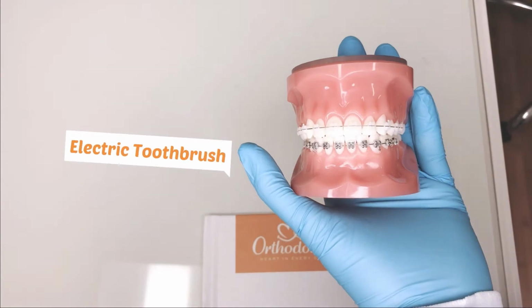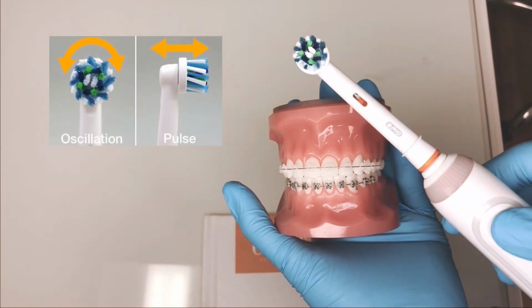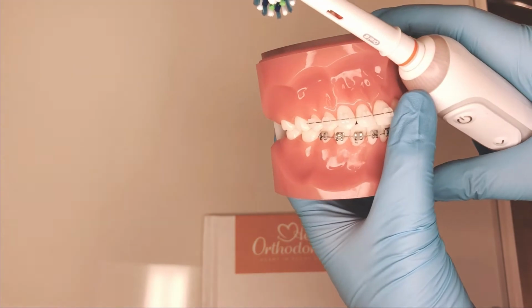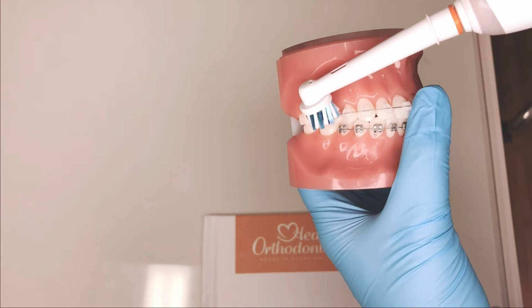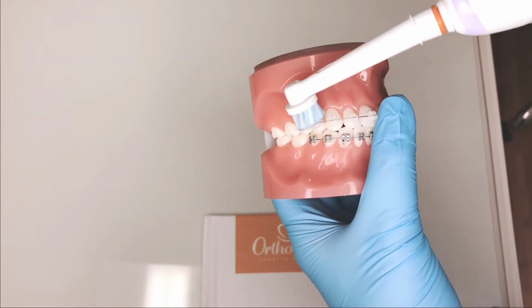We highly recommend electric toothbrushes with rotating and pulsing motions like the one pictured. If you have one with sonic vibrations only, please make sure you're doing the same circular movements as with a manual toothbrush. With a rotating brush head, you just need to make sure to position it correctly.